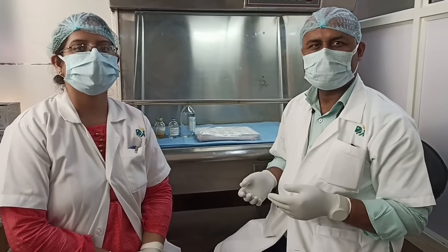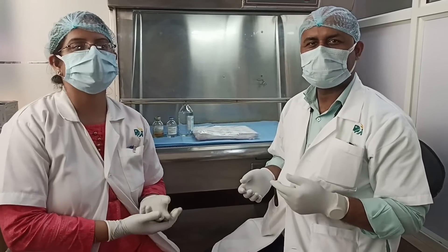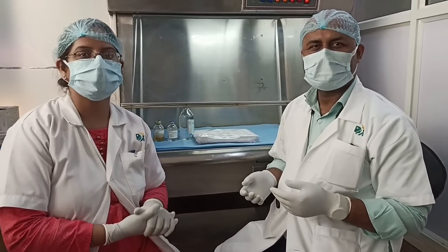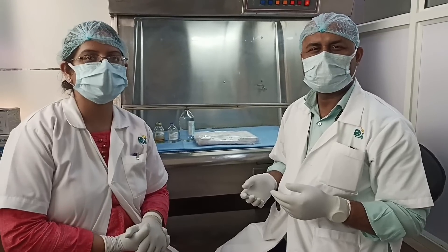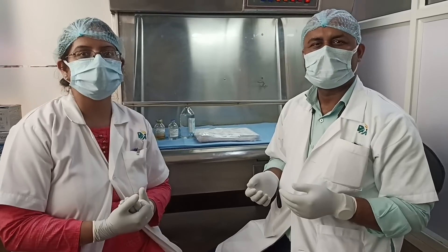Hello everyone. I am Dr. Ankita and he is Mr. Uday. I am the Registrar and he is the Chief Technologist at Indira Prastha Apollo Hospital in New Delhi, Transfusion Medicine Department. Today we are going to tell you how to prepare a cryoprotective solution.